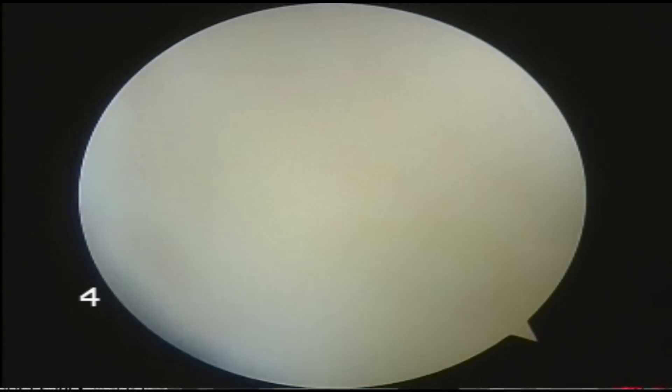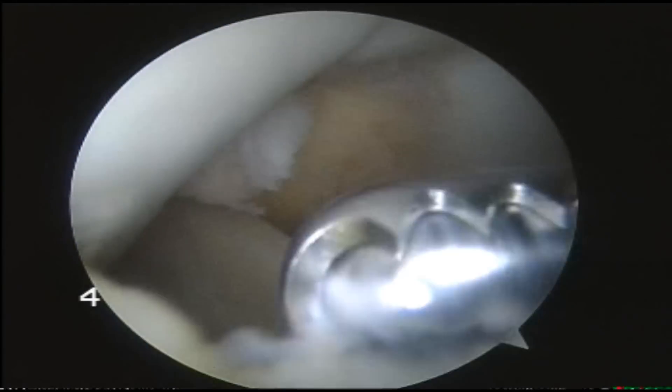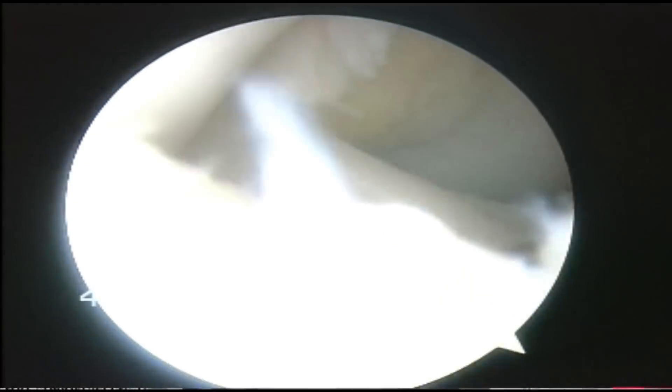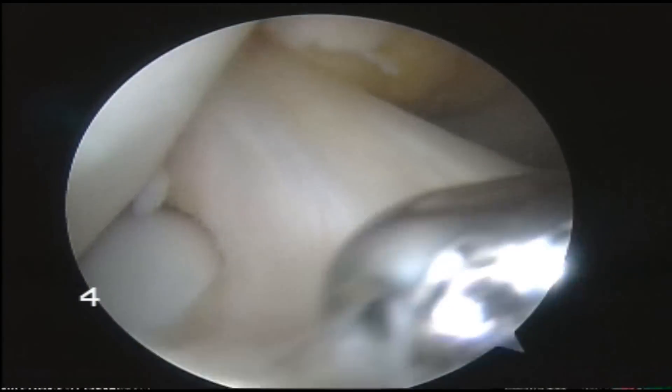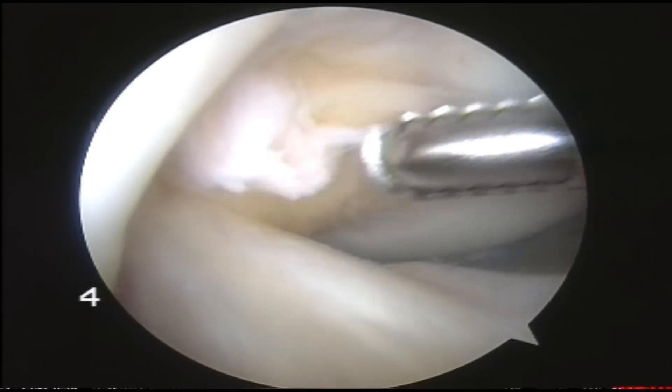When you're doing this operation it's really important to remove as many of those loose bodies as is humanly possible. Otherwise they just act as third body wear. They're pretty soft — they're not going to produce rapid wear but they're going to produce wear.